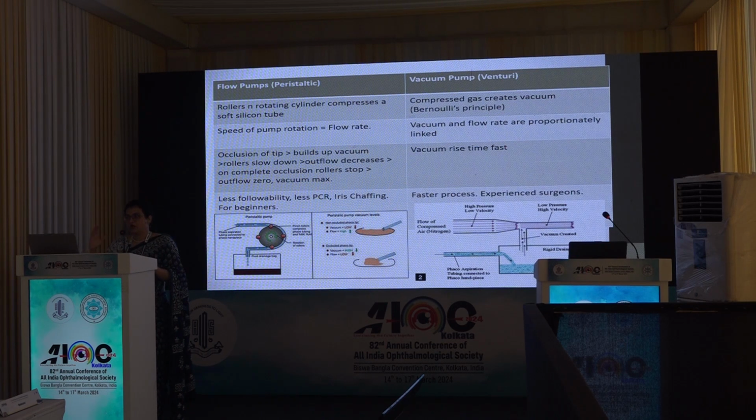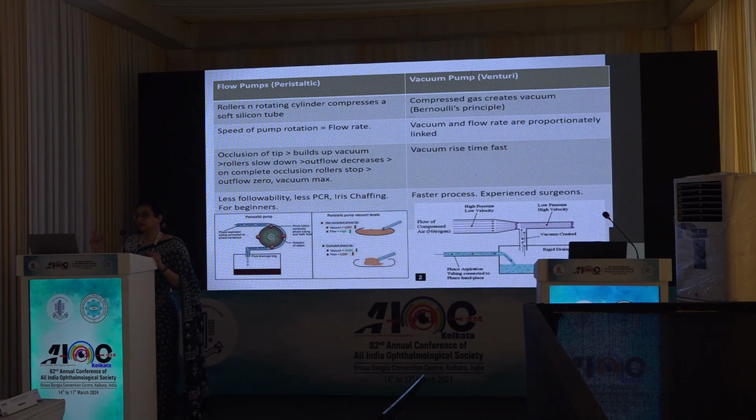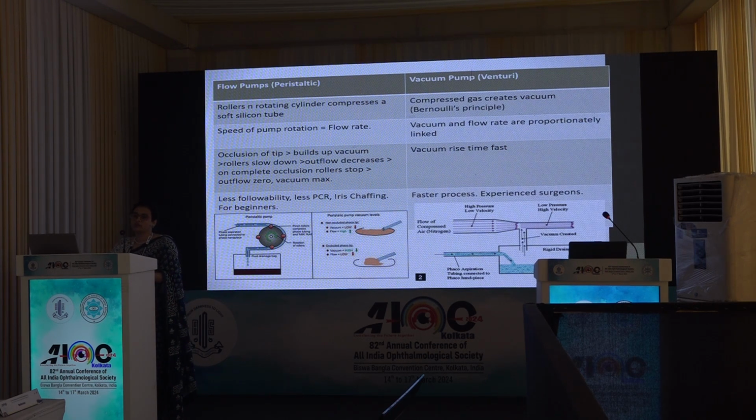so it is better for beginners. On the other hand, we have Venturi pumps, which are vacuum based pumps, depending on compressed gas. There is a gas cylinder which is compressed and generates the vacuum, based on Bernoulli's principle. So here the vacuum and flow rate are proportionately linked. Vacuum rise time is fast, the process is faster, so it is better in the hands of experienced surgeons.